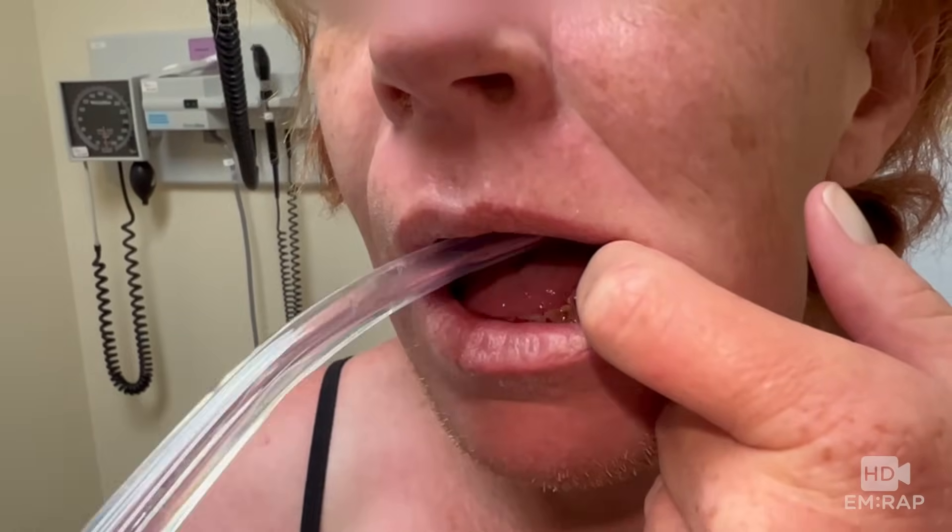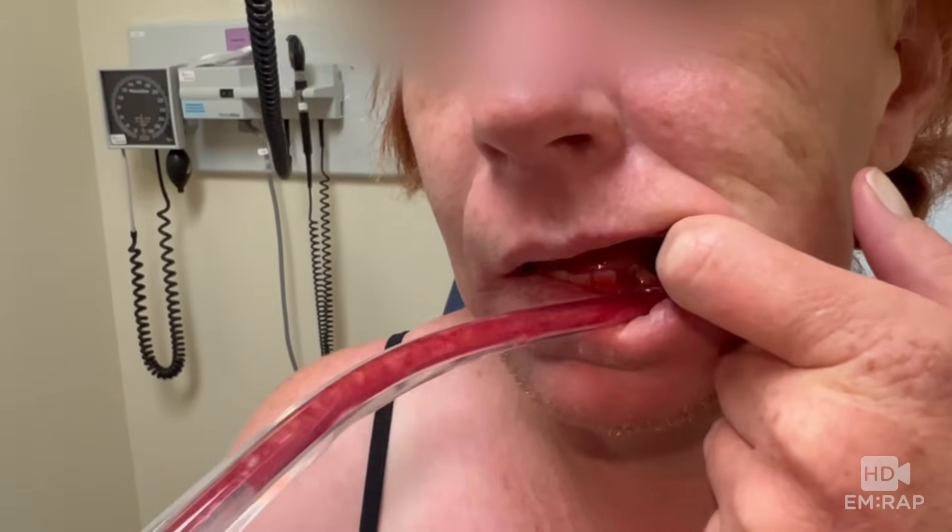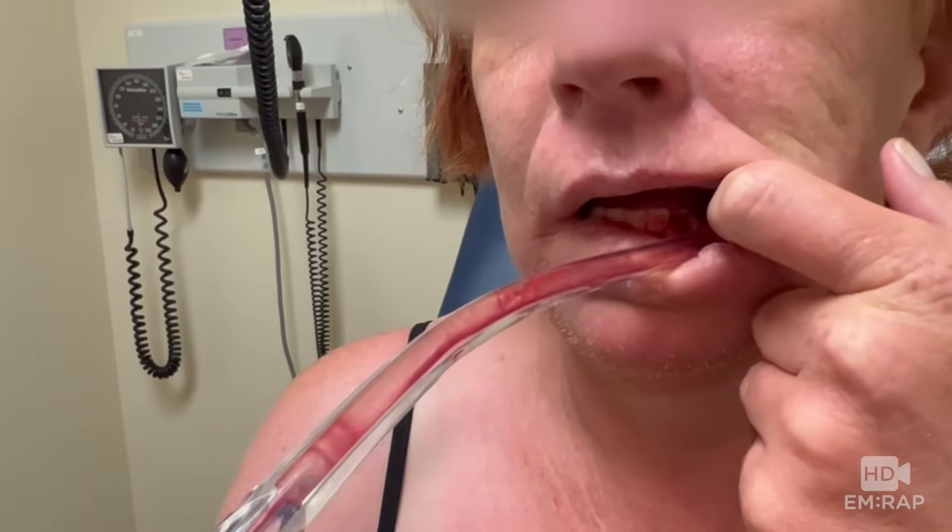You can give the patient some gauze if there's persistent oozing until it stops. Also give them something to spit into and let them hold their own suction.